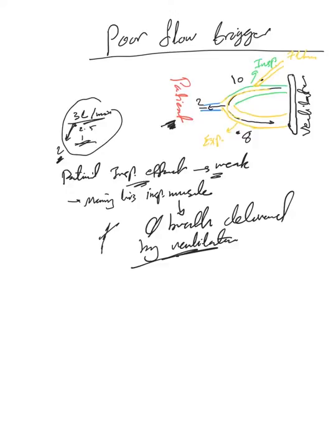The problem here is that the patient now has to pull this amount plus the extra amount here, 7 for example. So instead of the patient needing to pull 3 liters, now he has to pull 10 liters, and that can happen when you give continuous nebulizer treatments through the ventilator circuit.